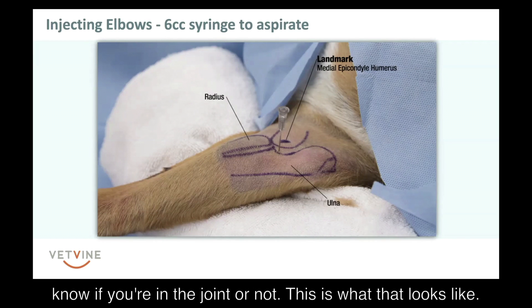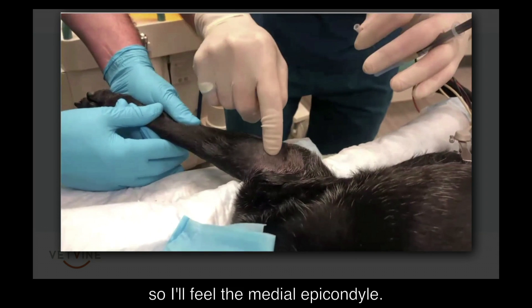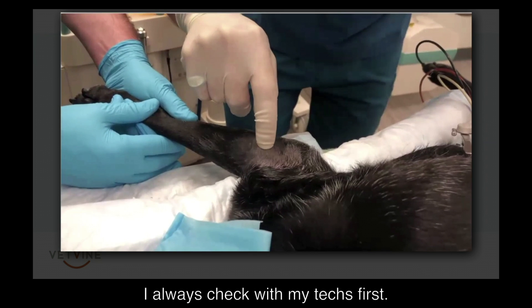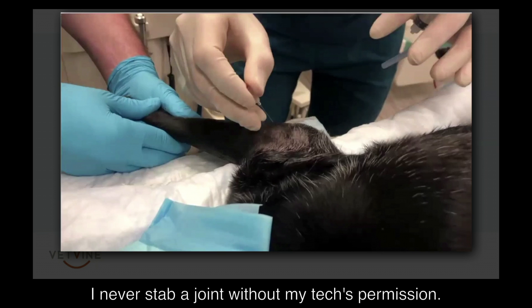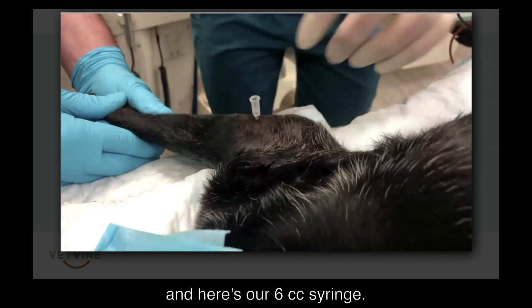This is what that looks like. Sometimes I have an assistant to break open the joint for me. I'll feel the medial epicondyle — I always check with my tech first. I never stab a joint without my tech's permission. Once we know the patient's ready to go, in we go, and here's our 6 cc syringe.